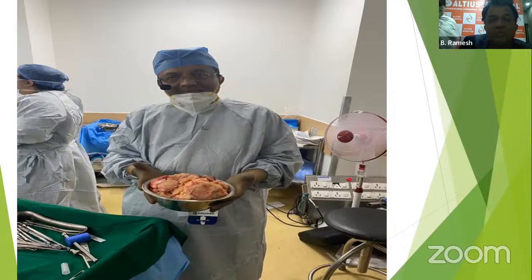So many times we are able to morcellate by any of these methods: either vaginal morcellation, combined laparoscopic and vaginal morcellation, in-bag morcellation, and mini lap morcellation. So these are the 4 to 5 methods of morcellation wherein you will be able to morcellate the tissues and retrieve the uterus. Thank you so much for your patient hearing, and sorry for the inconvenience of the videos.